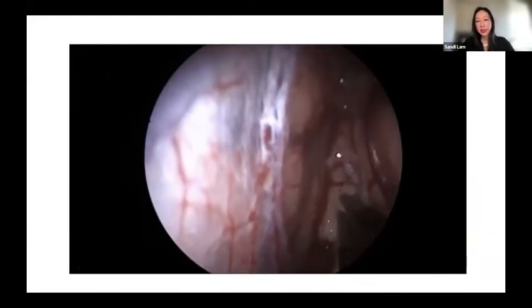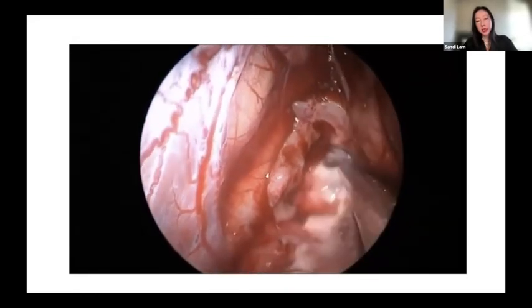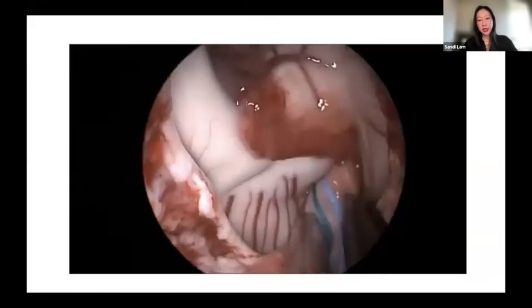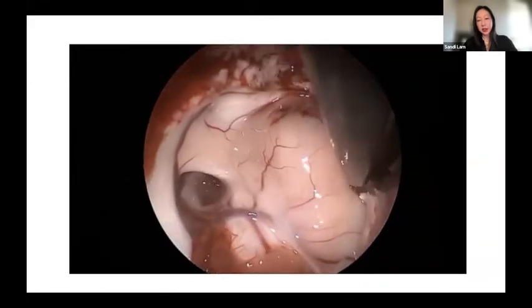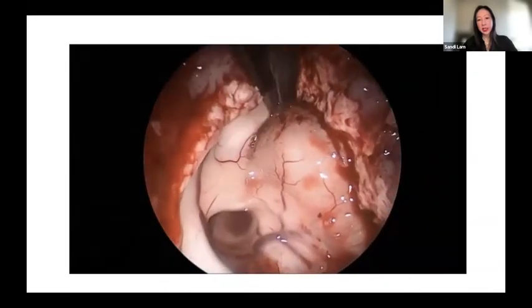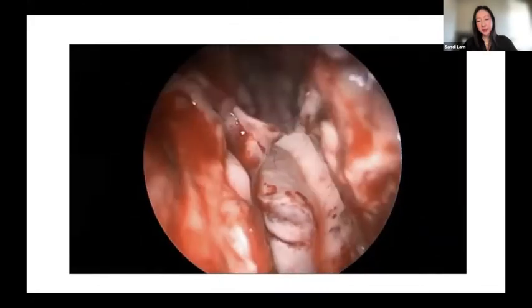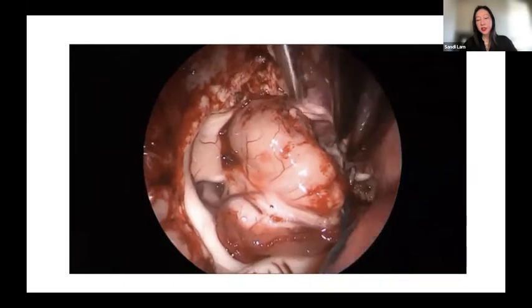It looks just like the callosotomy, right? An interhemispheric approach. And then working through the corpus callosum, getting into the ventricle. And then now this looks familiar, right? We're looking at choroid plexus, looking at the atrium. And here I'm putting a cottonoid patty into the temporal horn. And then working around the caudate, because I know once I go lateral to the caudate, and I find my temporal horn, I'm actually able to see the entire ventricular system from up top.